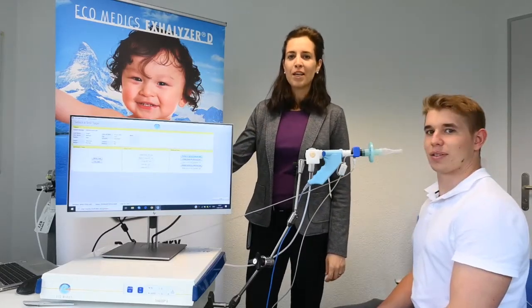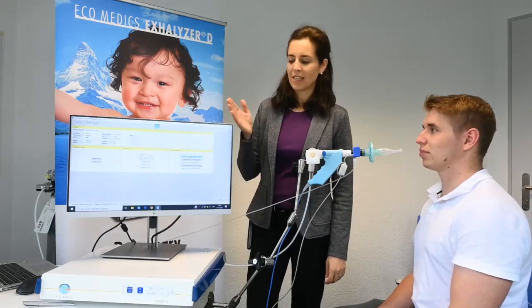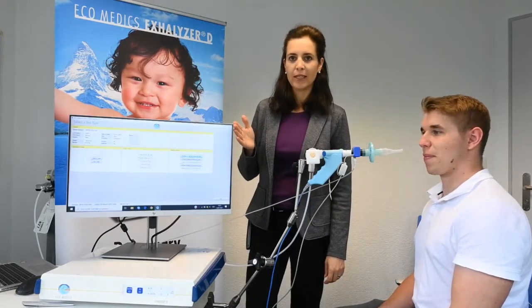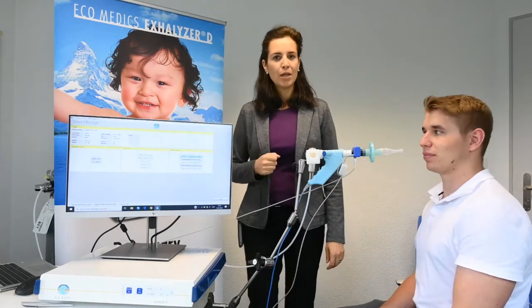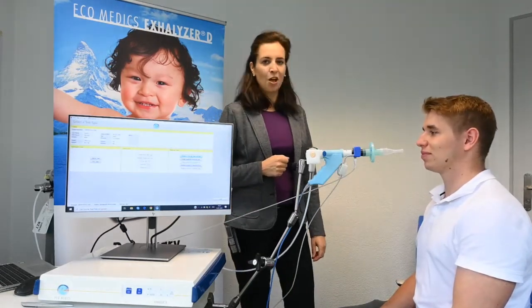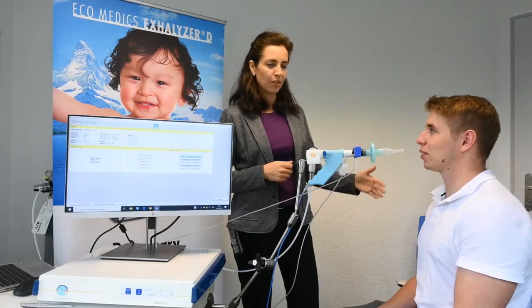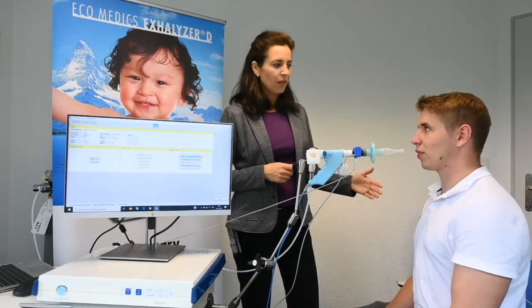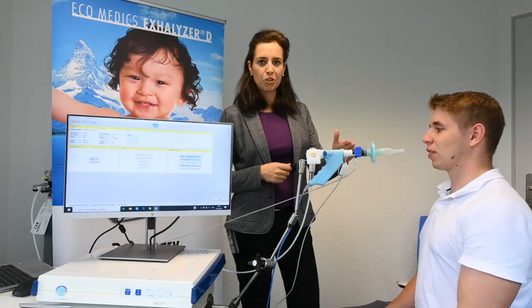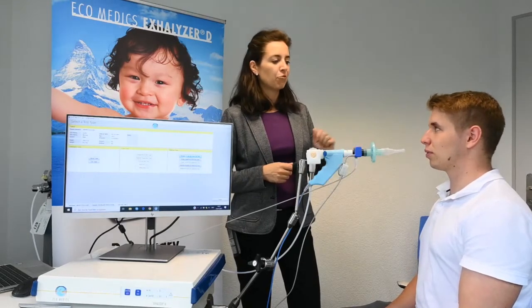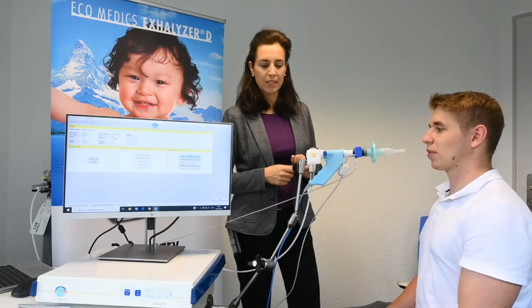We have already entered the subject's data in SpiroWear software like birth date, weight and height. And now we are ready to start the test. For the test itself, the patient should sit in an upright and comfortable position, and the measurement setup should be positioned in a way that it can be reached easily by the subject.